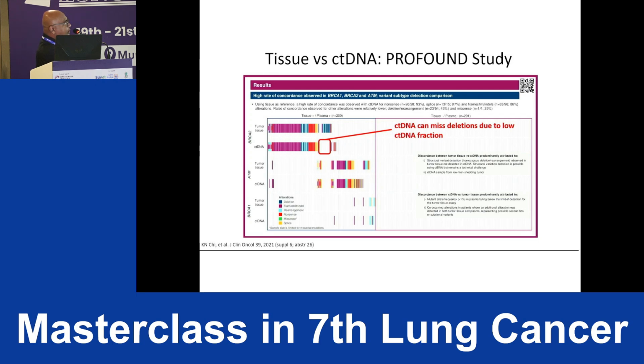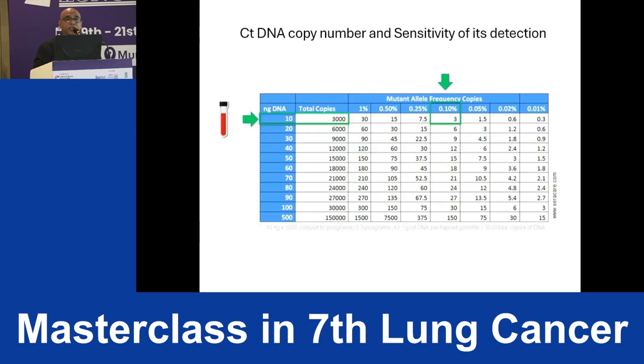It looks like a homozygous deletion, but actually it was not. This came out so because the ctDNA fraction of these patients was under 1%. So what are the variables that underlie this? We will get into that, but I also wanted to emphasize why this is very important.